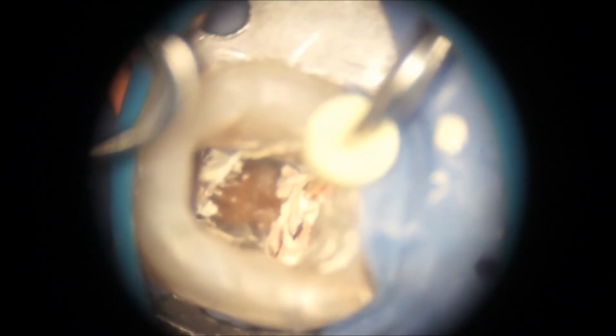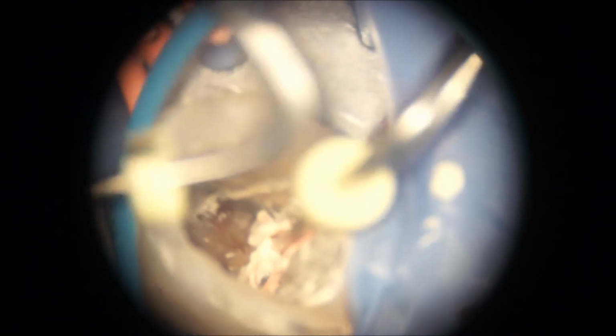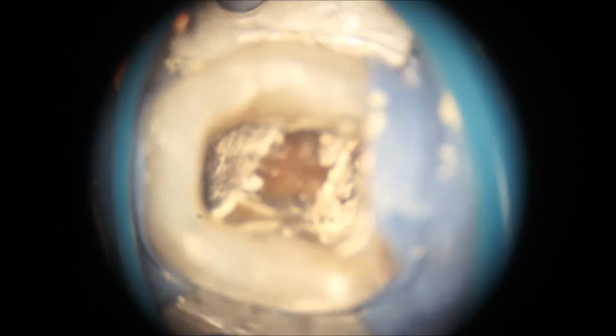A lot of patients would have had the tooth removed very promptly, but she hung in there, and as a result of that, I was able to obturate. I'm using a vertical condensation technique with heated GP. The distal canal had a huge apical foramen, in the region of size 50 ISO. This was also the canal that caused the flare-up. It constantly wept exudate when I saw the patient on her second appointment, at which we remedicated the tooth.